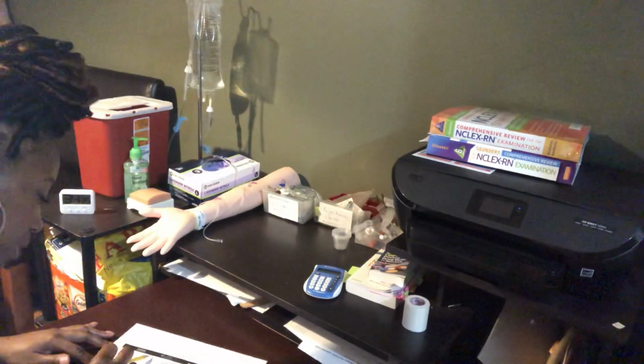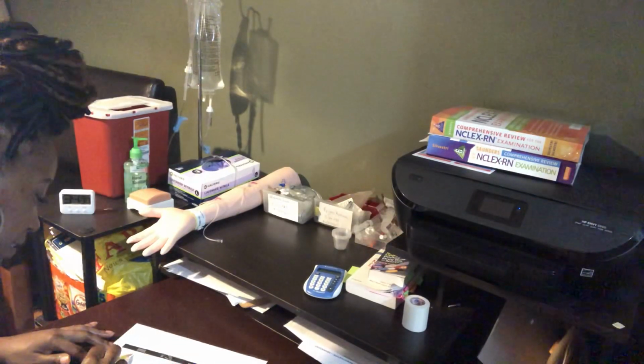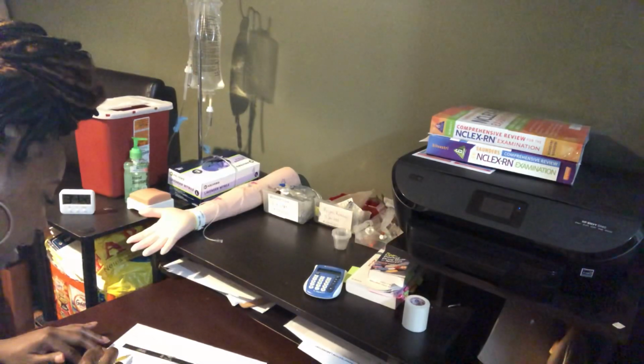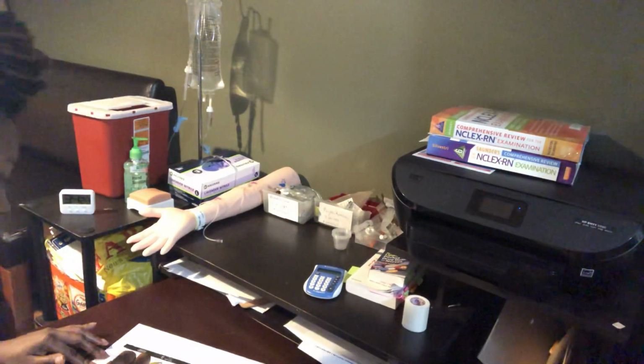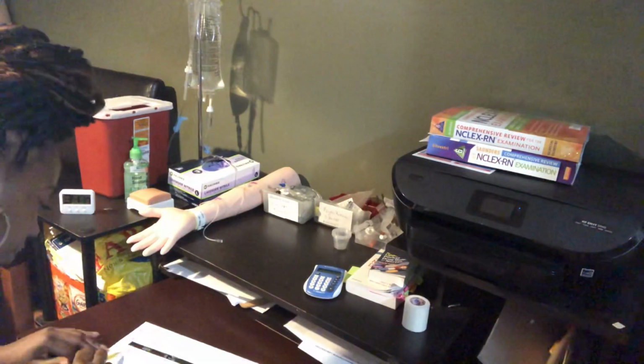Cefazolin 100 milligrams in 50 milliliters 0.9% sodium chloride IV mini bag. Give over 30 minutes 2 times a day. Drop factor is 20. Give at 1800. I'm giving this medication. I might give this medication.